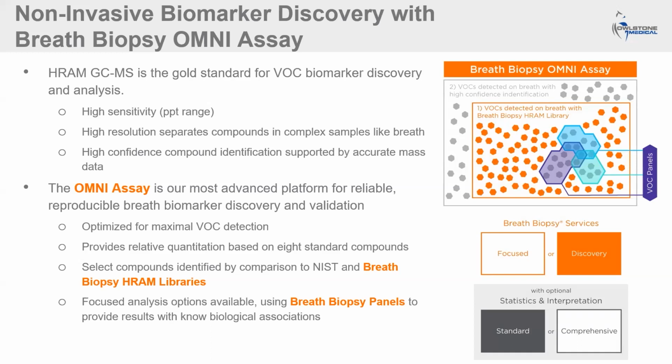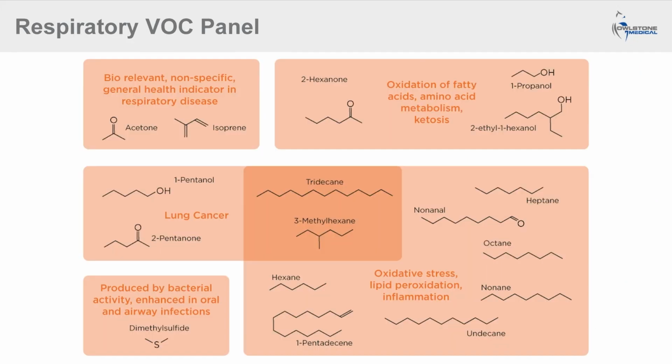For many of these VOCs, we may know the biological origin or function, which allows us to build targeted panels in specific disease areas. Here's an example of a targeted panel. This is our respiratory panel, and it contains VOCs previously implicated in chronic inflammatory diseases of the lung.